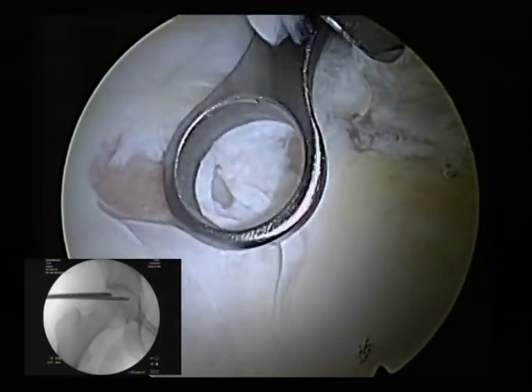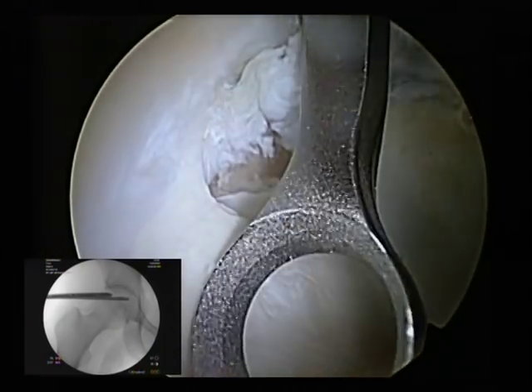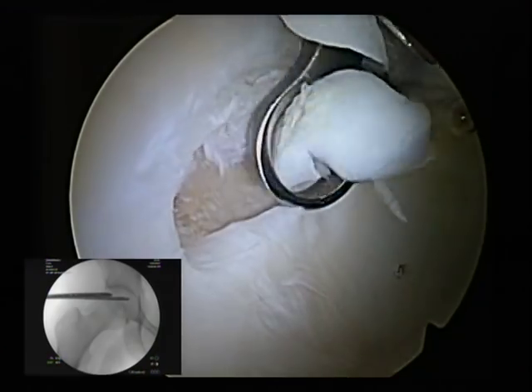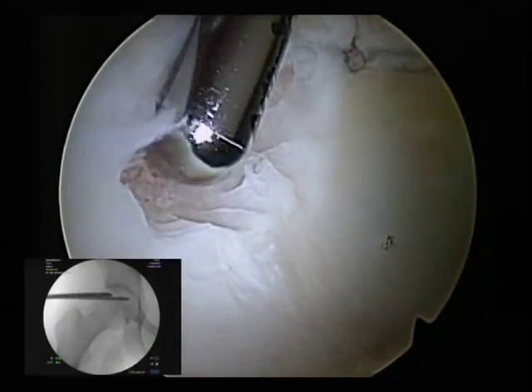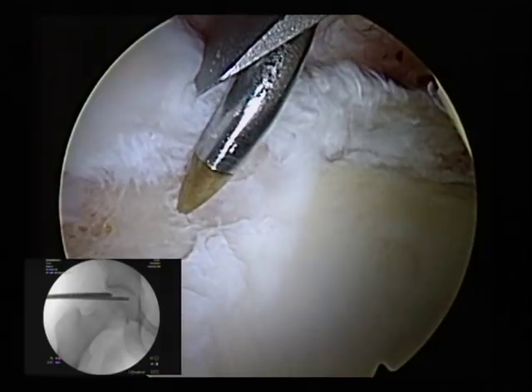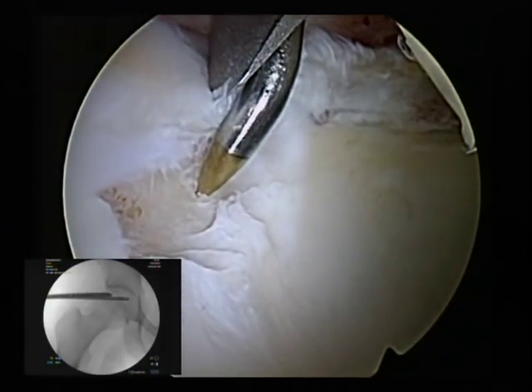We can see a little bit of labral degenerative tissue, and just beyond it is where the normal labrum is — we'll elevate that labrum out in a couple of minutes. This ring curette is about five millimeters, so we're taking five to seven millimeters of cartilage out. We'll trim it back. Now we've got a pretty good area here that we can microfracture. This is a standard chondral tool that allows us to do a little bit of a chondroplasty here.